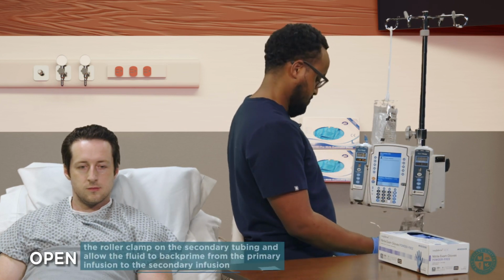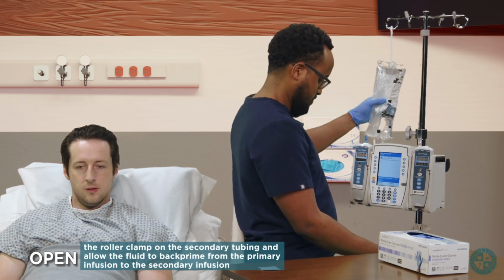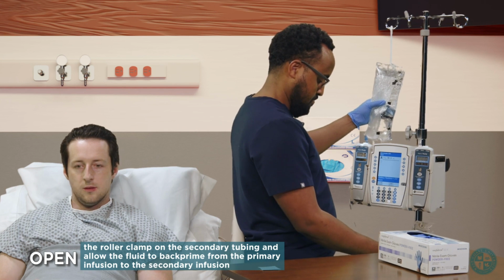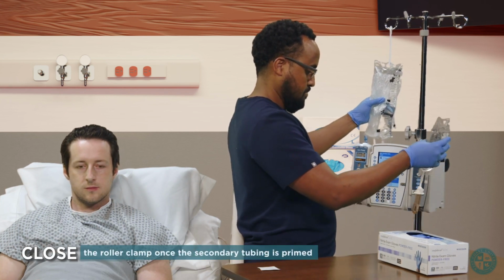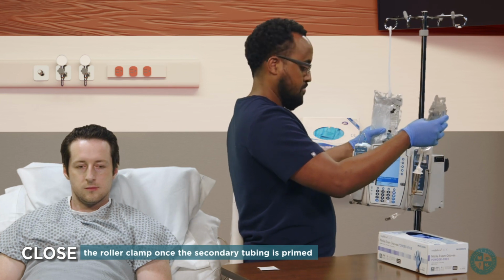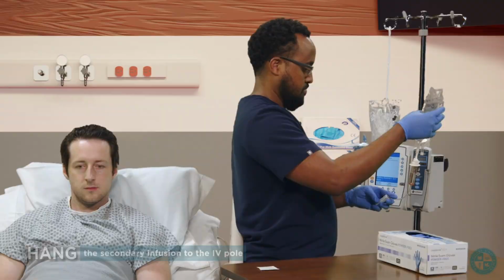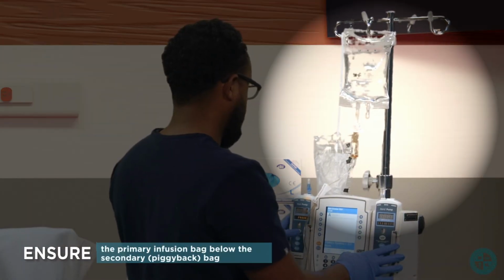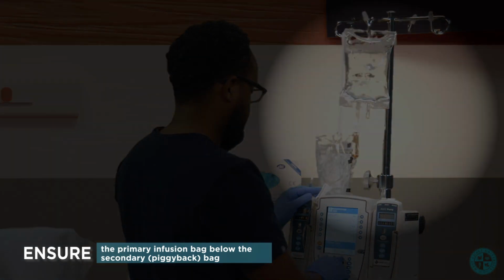Open the roller clamp on the secondary tubing and allow the fluid to back prime from the primary infusion to the secondary infusion. Close the roller clamp once the secondary tubing is primed. Hang the secondary infusion to the IV pole. Ensure the primary infusion bag is below the secondary, aka the piggyback.